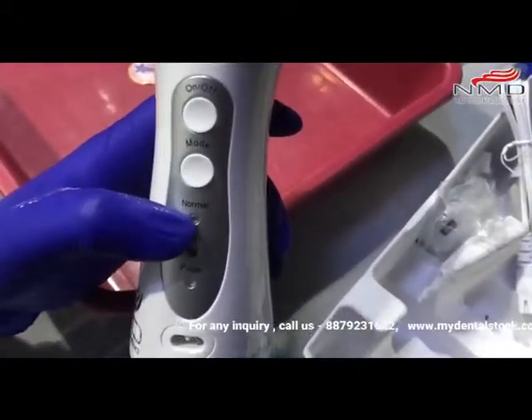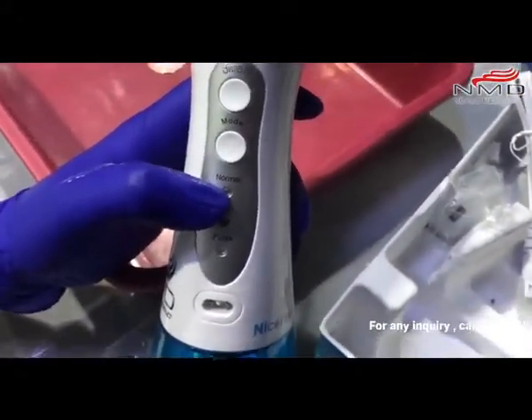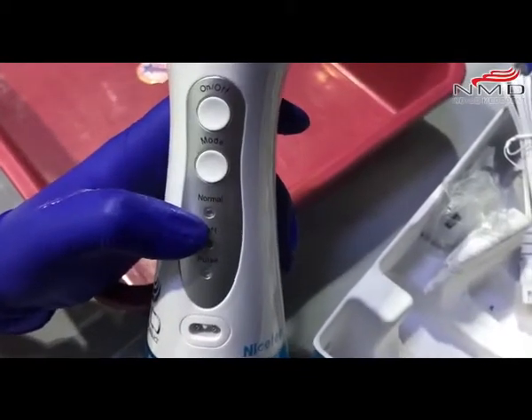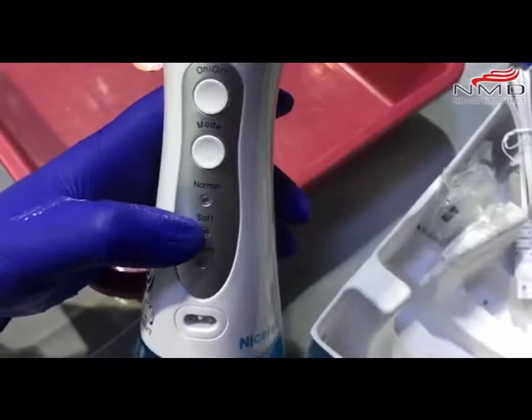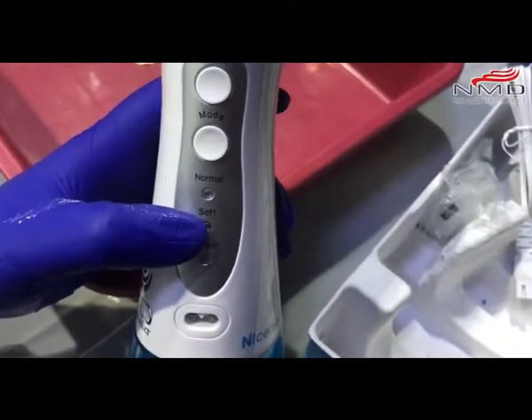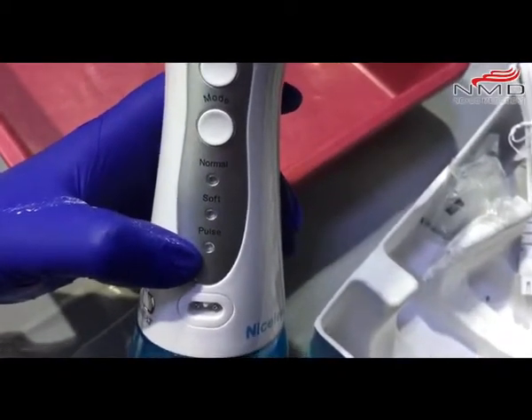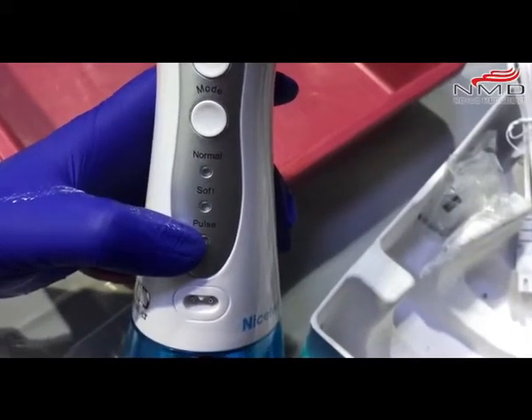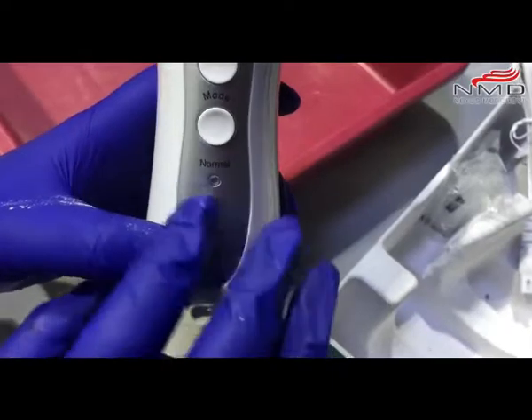There are three modes. In Normal mode, the water pressure is 60 to 100 PSI — that is the standard mode. In Soft mode, the water pressure is 30 to 60 PSI, and Pulse is also 30 to 60 PSI. Soft mode is basically for gentle use.